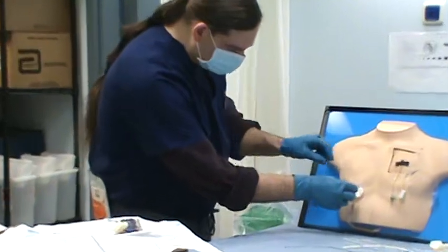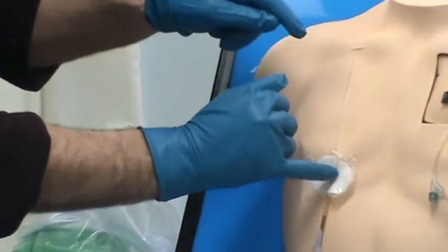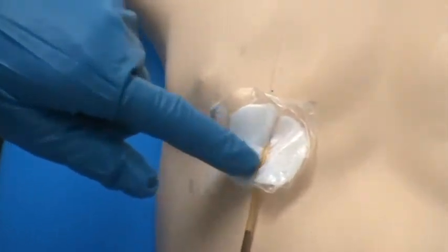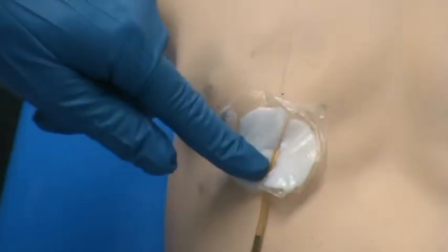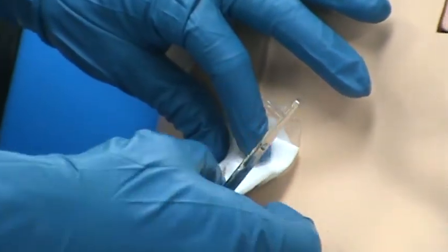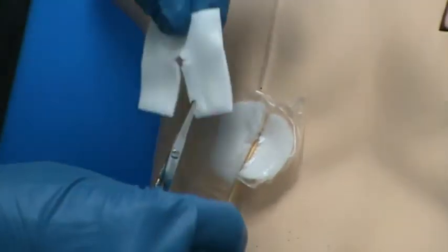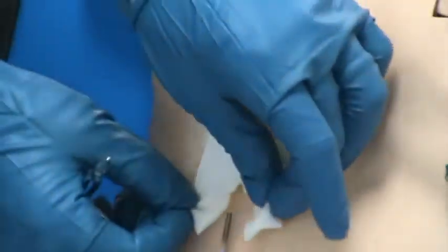Now, if you can zoom in here, there is a line right there. Down here is solid. Now, whoever put this on made it really tough for me because they put it on like this and then put tape on it. So now, see, the tape is hooked in between here. What you should do is put it on like this so that when I rip the tape off, it'll come right off, and there's nothing holding it in.